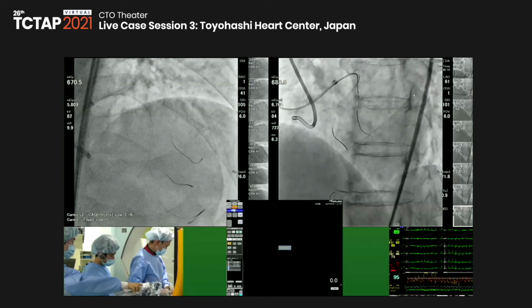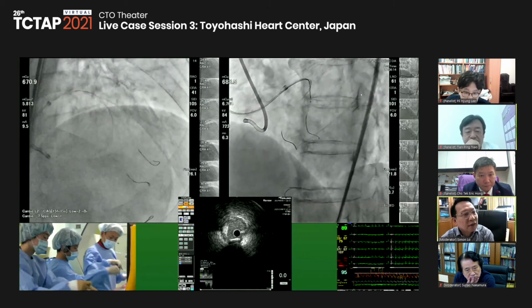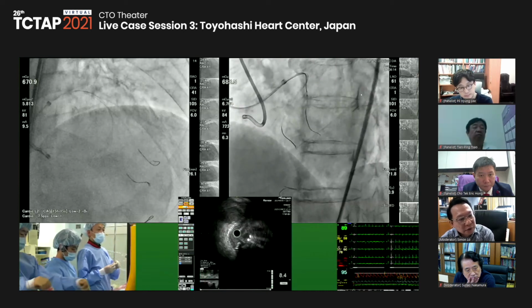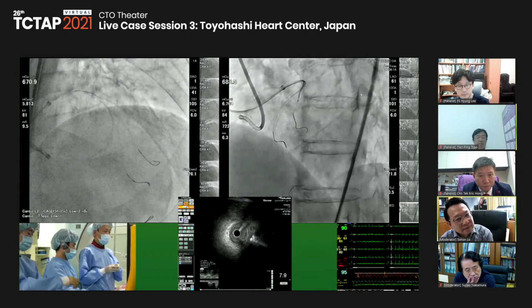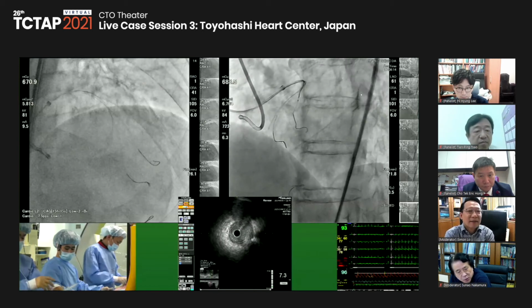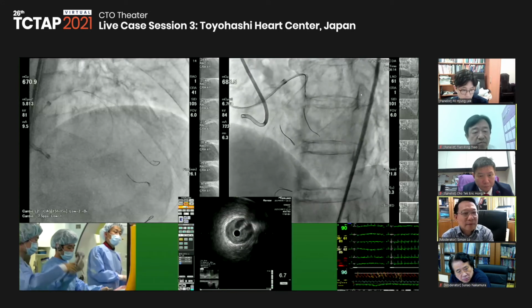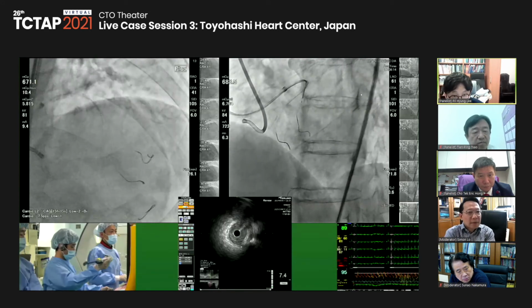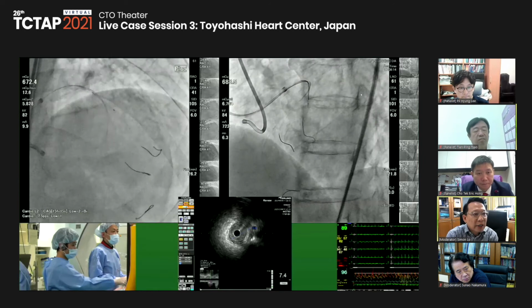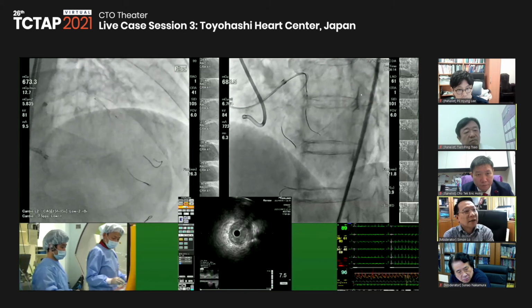I see. So knowing that there may be some compromise of the first diagonal after stenting, would you modify the plaque first? No, I'm just keeping the balloon. I see. You're keeping the balloon inside. Yeah. And after dilatation, I want to do the final kissing inflation. So what's the balloon size you're keeping in the diagonal? 2 is enough. Is that going to be a brand new 2.0 balloon? No, it's an old one, already used.